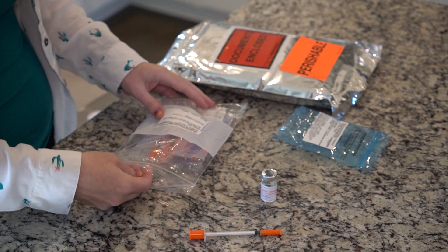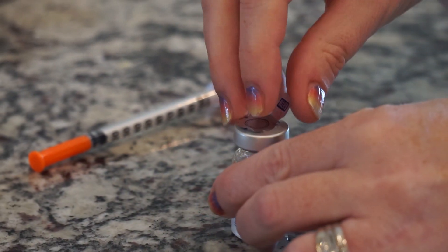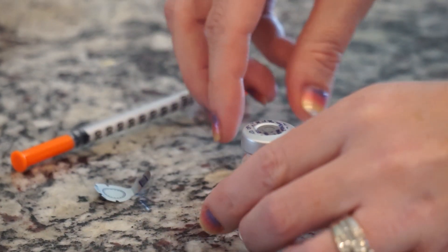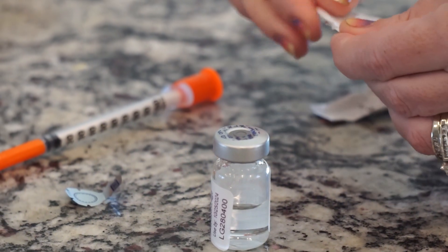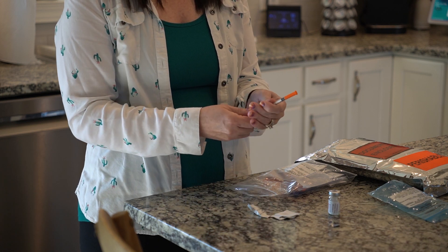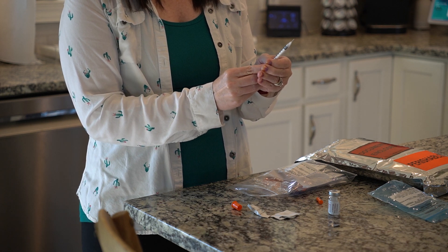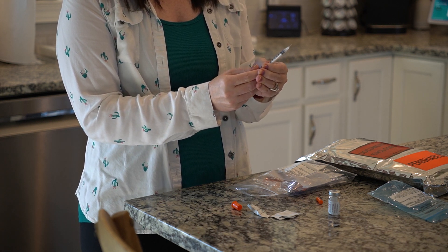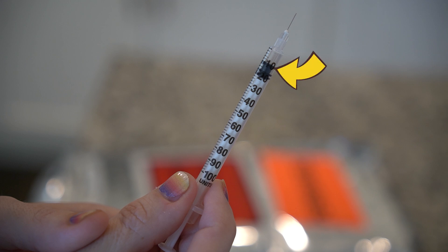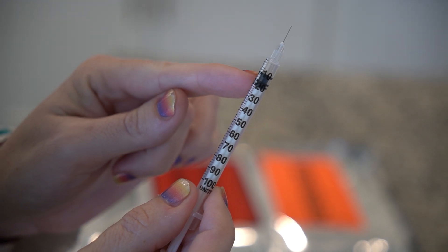Then you can assemble and check your equipment. The medication we offer comes in a vial, so you will need to draw up your medication. If it is a new vial, you will need to remove the safety sticker. Next, you will need to clean the rubber stopper with an alcohol pad. Then carefully remove the cap on the syringe and pull the syringe plunger back until the air in the syringe equals the volume of the medication to be withdrawn from the vial. For example, if you are supposed to inject 10 units of medication, you will draw back 10 units of air into the syringe. The top of the black stopper should be on the 10 unit mark.